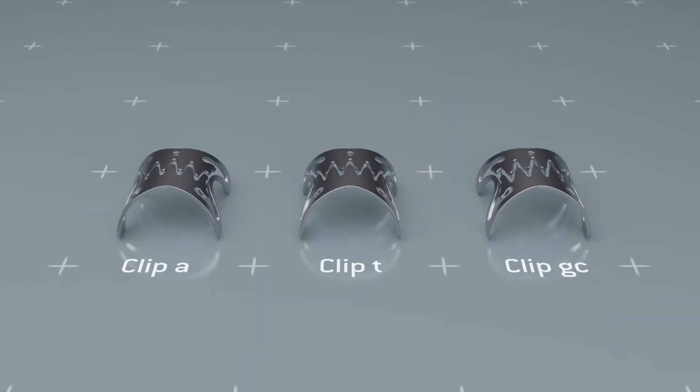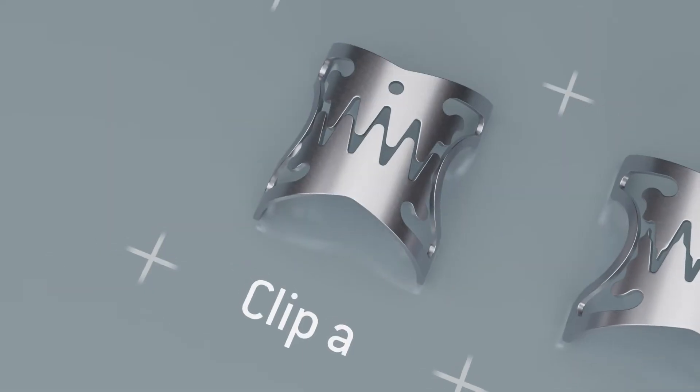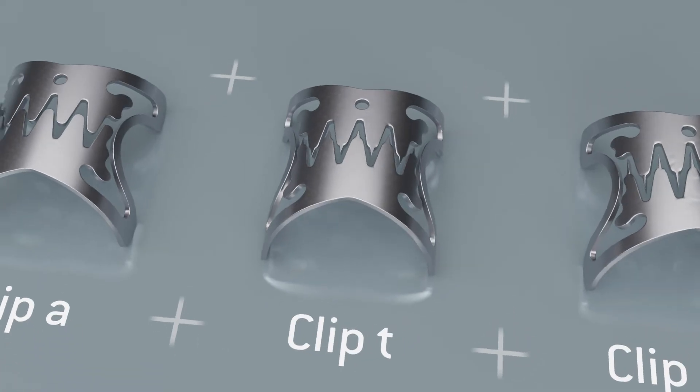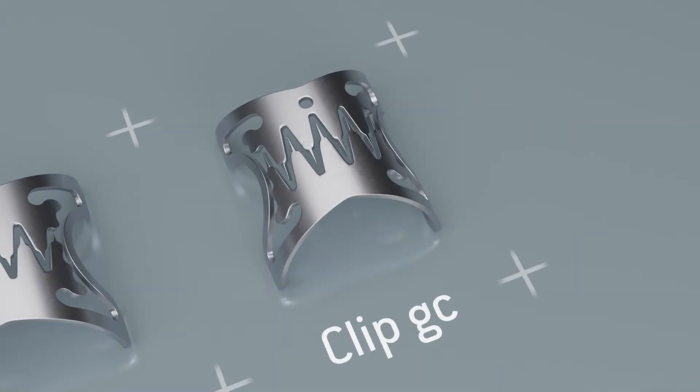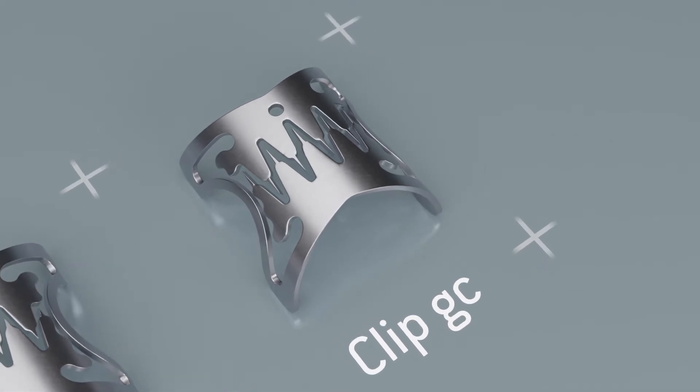There are three different versions of the OTSC-Neo clip: Type A with blunt teeth, Type T with pointed teeth, and Type GC with longer pointed teeth, specifically for the treatment of perforations and lesions in the stomach.